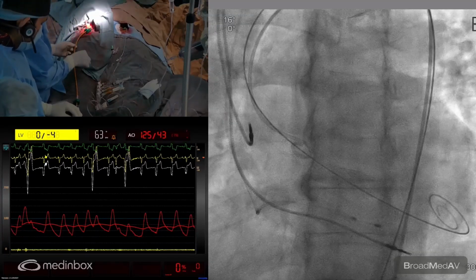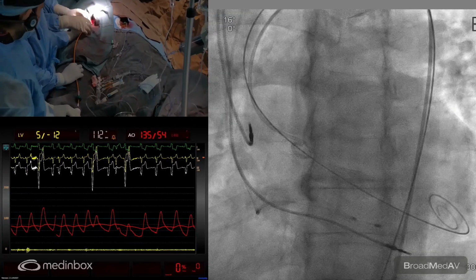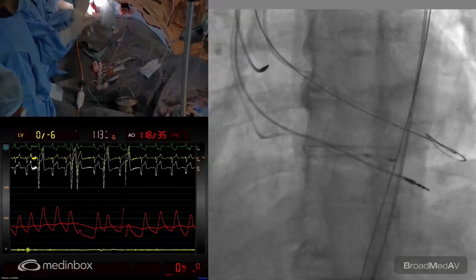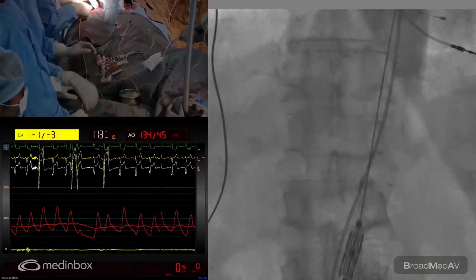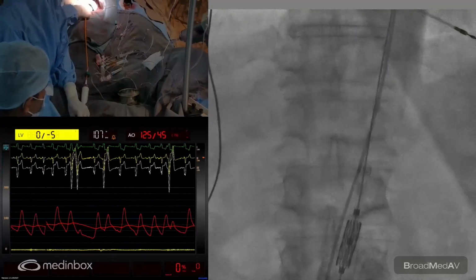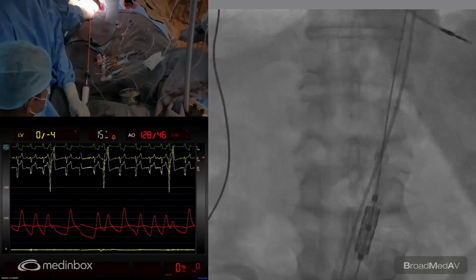Okay, just come to the aorta. Descending aorta, I think we're at the tip of the sheet. Come to the AP. AP, so you can see it's right at the tip now. This is always a problem. So just show the top wire also if you can.